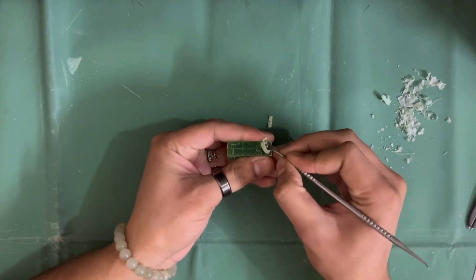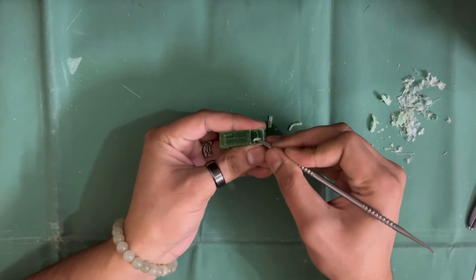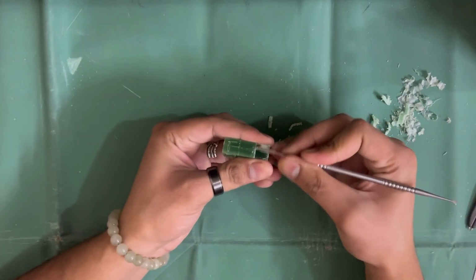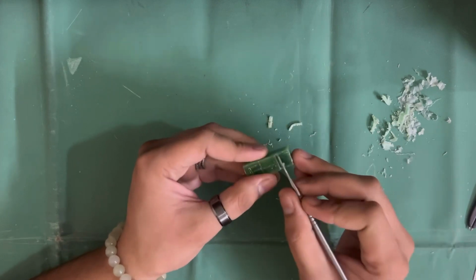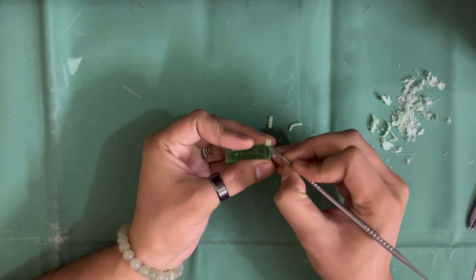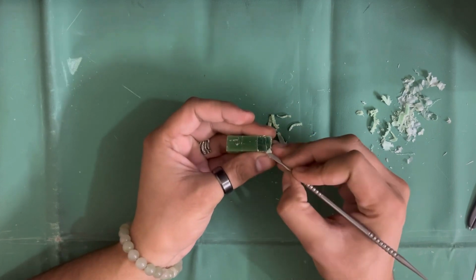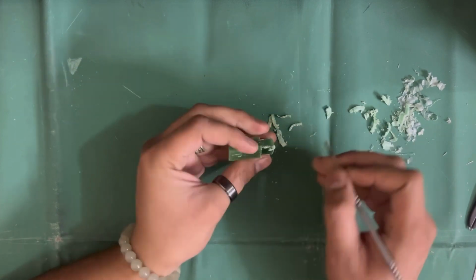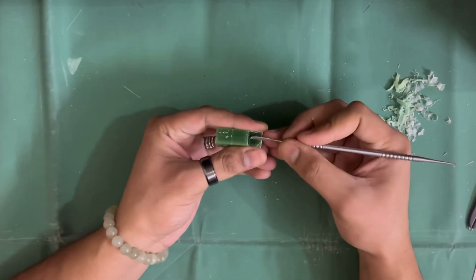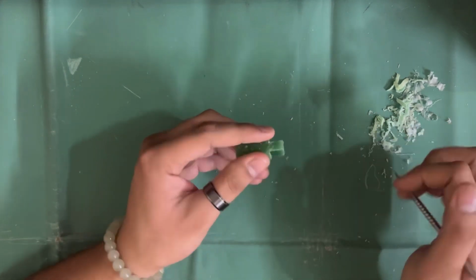So we'll carve out the extra wax from the labial and your palatal side. Make sure you don't carve out extra, okay? Rather leave a little extra wax there, so that you still have a scope of correcting it later. Now making sure that we don't carve those curvatures of the cervical line.